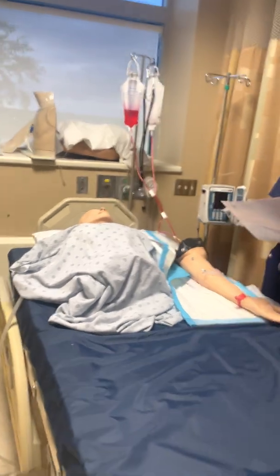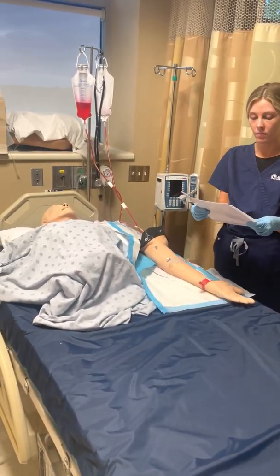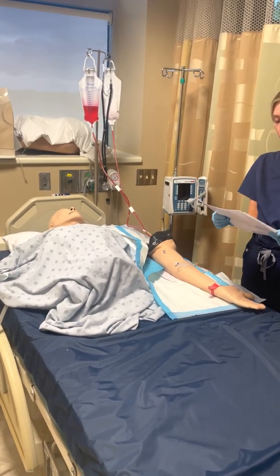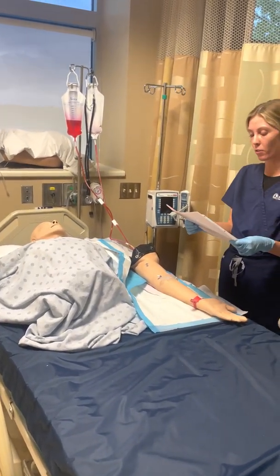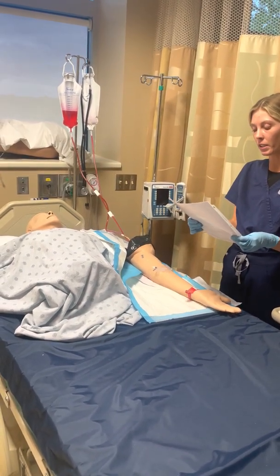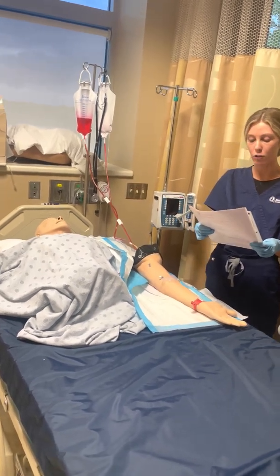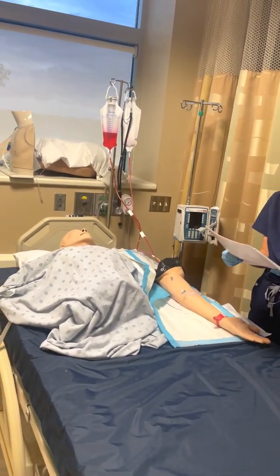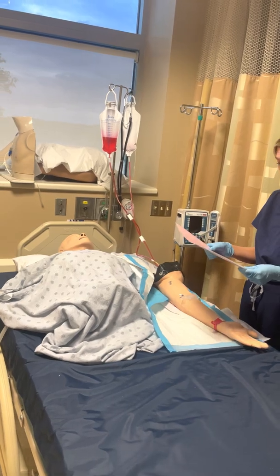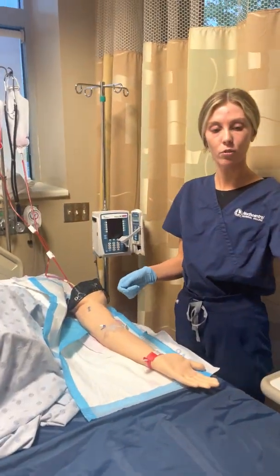Expiration date and time is 11/21 of 2022 at 1500. Expiration date and time 11/21/2022, 1500. And the donor blood type is O positive. Donor blood type O positive. Compatibility test says completed. Compatibility test completed. And on 8/26 of 2022. And that was dated 8/26/2022. Thank you. All right, he has the blood all ready for us. Thank you so much, Sam.